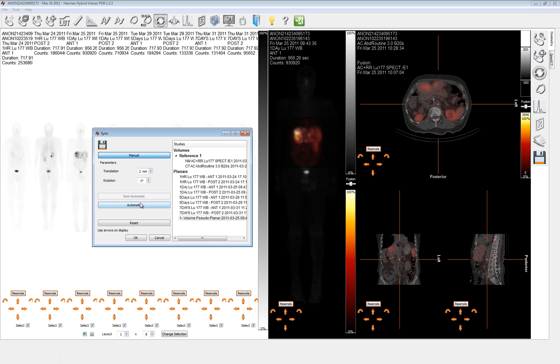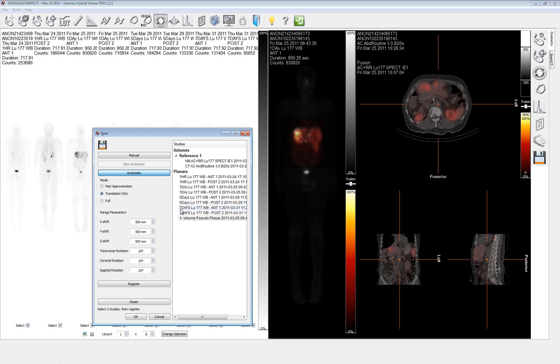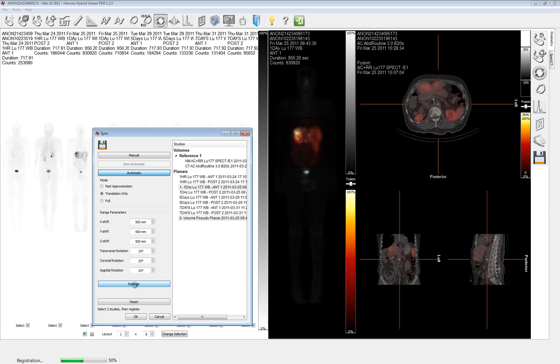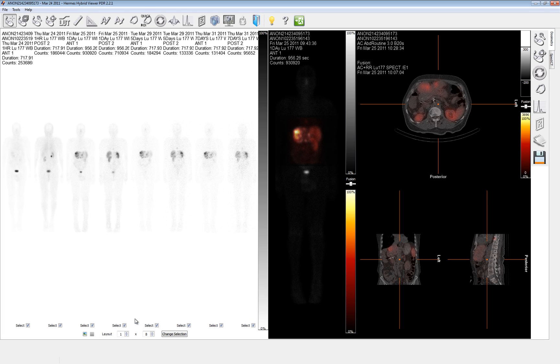We do a rough alignment only as the next step is to use our numerical method to do a registration between the two. Here we can see that's been completed. When we click OK, we will now use the mutual information of these two overlapped areas to correctly scale the SPECT and the whole bodies to each other so that the counts in one mean the same as the counts in the other.